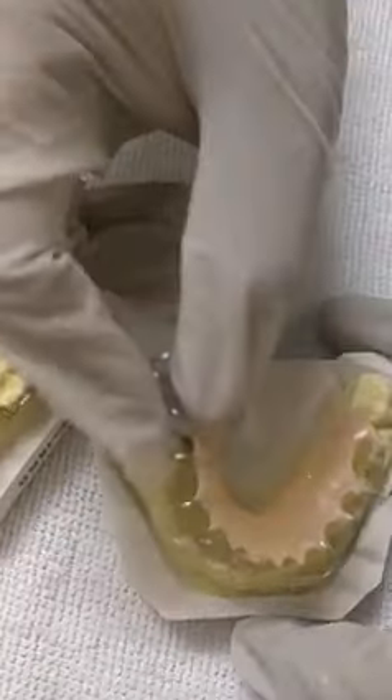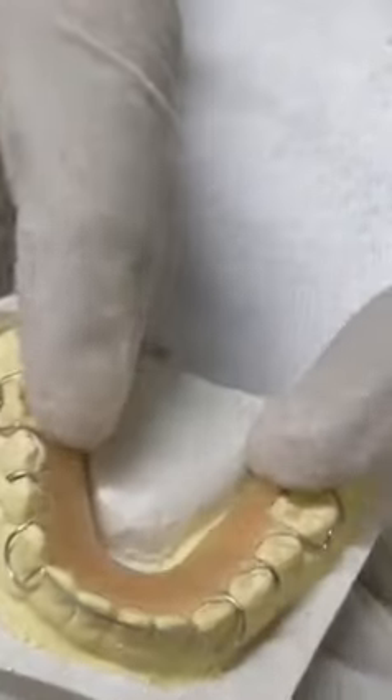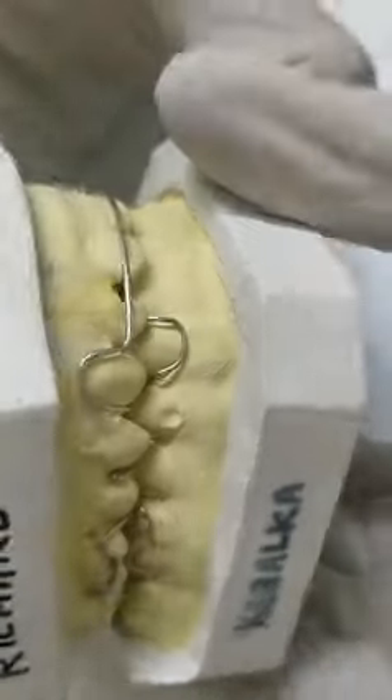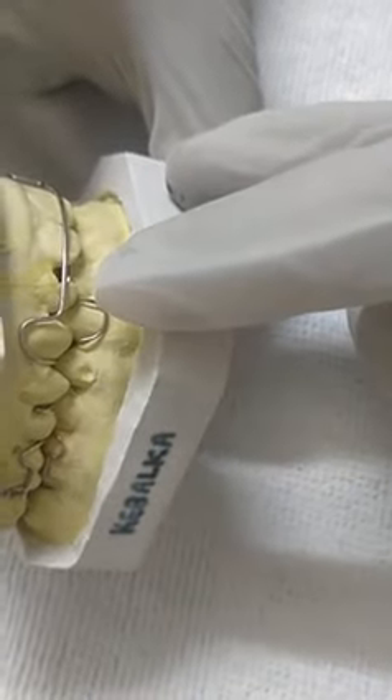You can just put it in and see the retention — it's not falling down. Now you can check the occlusion: the molars are on molars, premolars are on premolars, canines are on canines, with anterior overbite. Then here, premolars and molars are occluding.